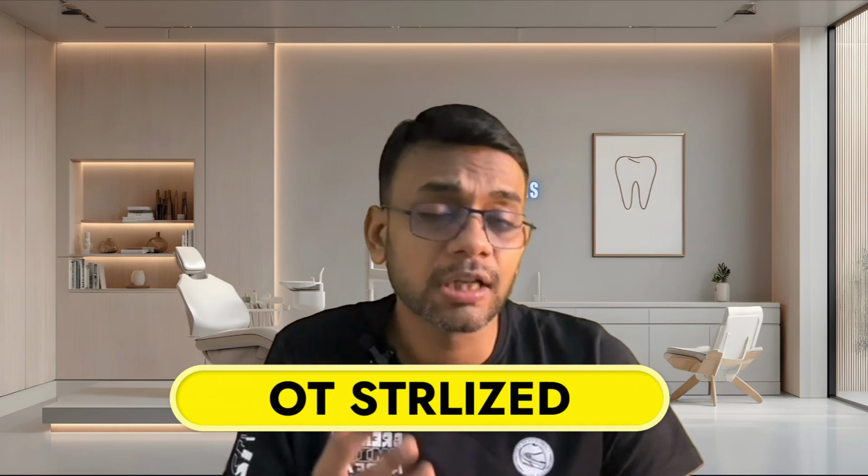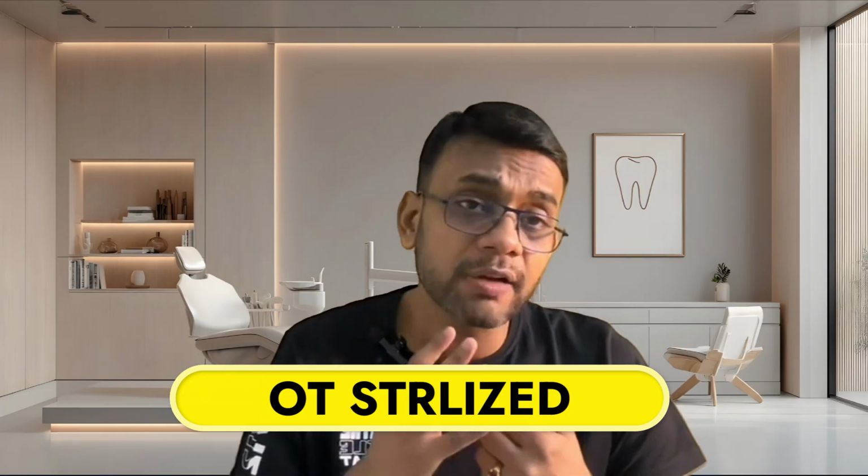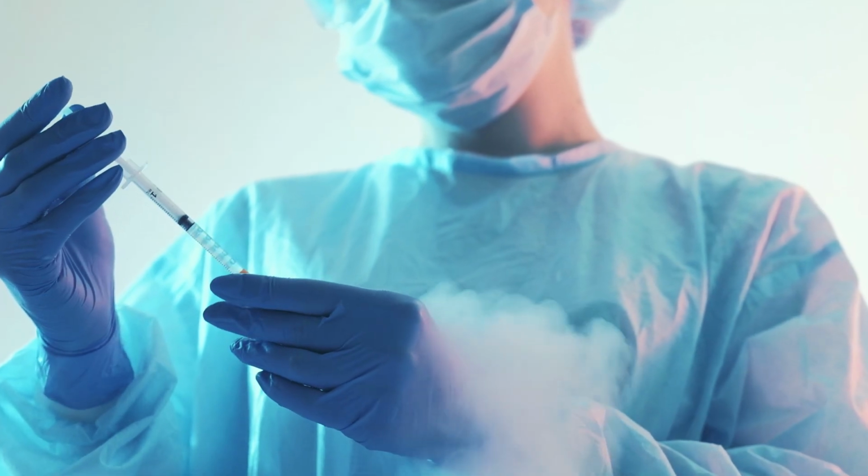Another point, if you really want to reduce failures in your implant practice, you have to focus on asepsis. Everything should be sterilized very well: the surfaces you touch, the air, the floor. You should be wearing proper protective equipment, along with the patient who is covered in proper protective clothing. That is very, very important.